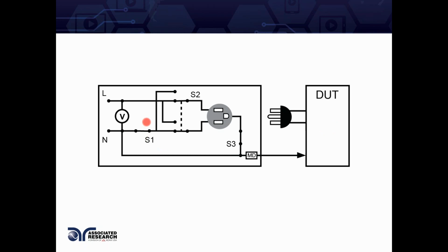And then you have a condition called open neutral. This open neutral is counterintuitive. You would think that your product is not powering, there's no power going into your product, so you're expecting no leakage. But in reality, the line voltage does go to your product just because there's no return path back to your neutral since the S1 switch is open, but the voltage is still being seen by every component in your product.